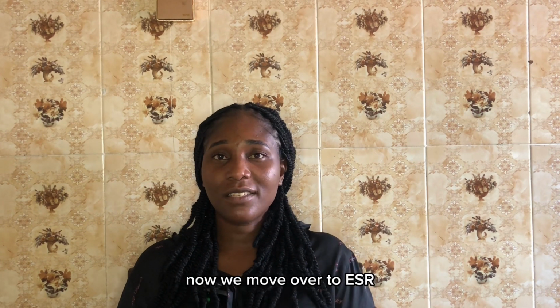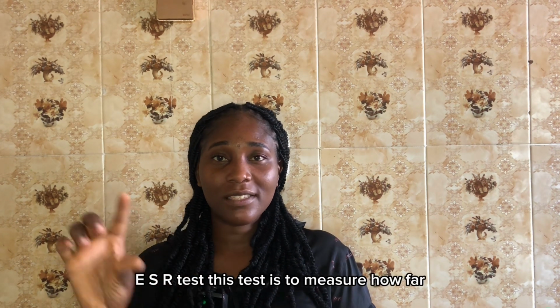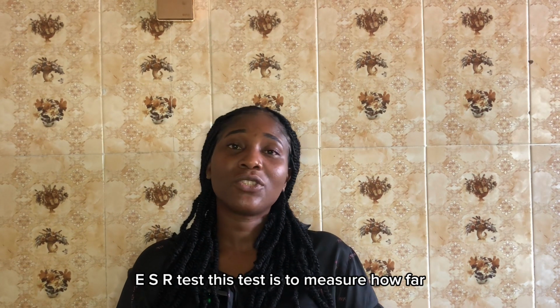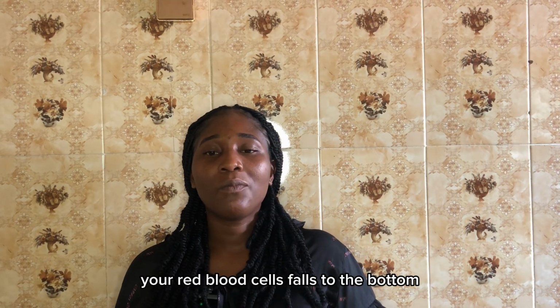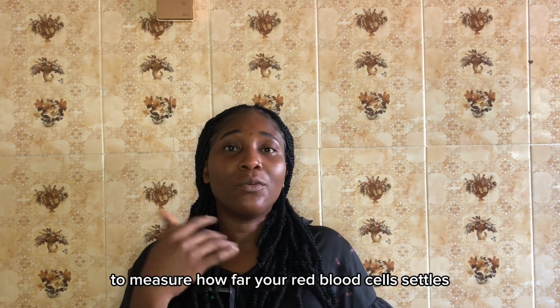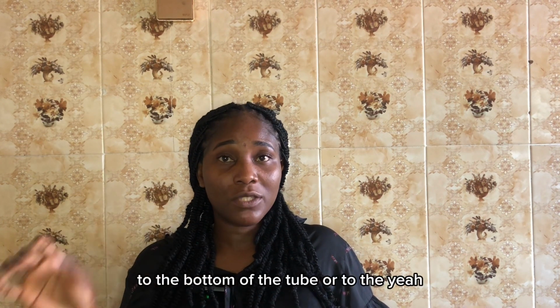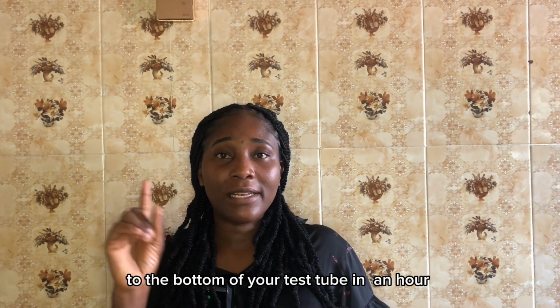Now we move over to ESR, which is erythrocyte sedimentation rate. This test is to measure how far your red blood cells fall to the bottom of the test tube within an hour. Let me come again. The ESR test is done to measure how far your red blood cells settle to the bottom of the tube in an hour.